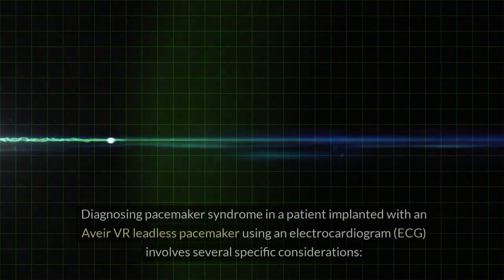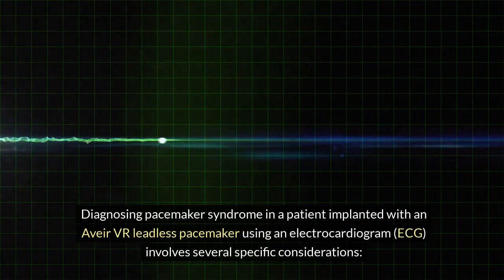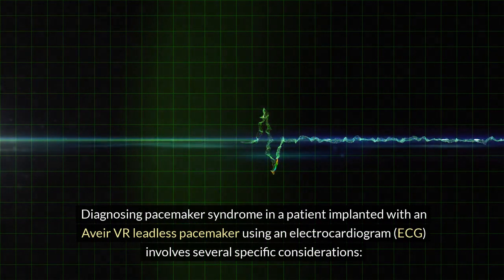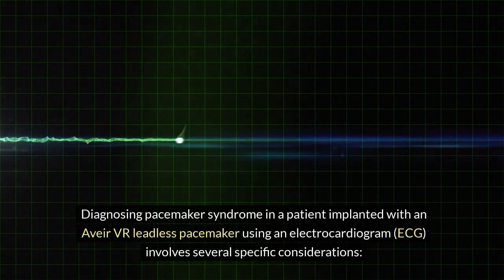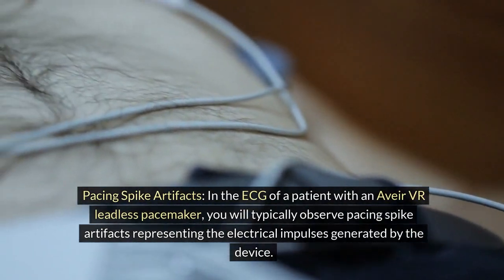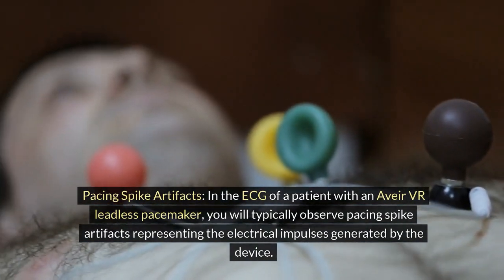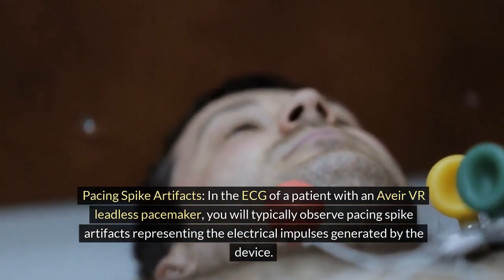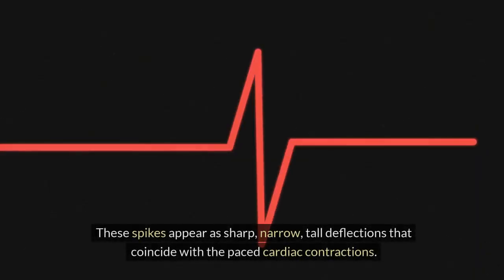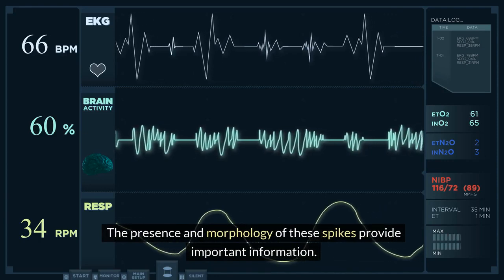ClaudeAI answer: diagnosing pacemaker syndrome in a patient implanted with an Aveir VR leadless pacemaker using an electrocardiogram, ECG, involves several specific considerations. Pacing spike artifacts. In the ECG of a patient with an Aveir VR leadless pacemaker, you will typically observe pacing spike artifacts representing the electrical impulses generated by the device. These spikes appear as sharp, narrow, tall deflections that coincide with the paced cardiac contractions. The presence and morphology of these spikes provide important information.